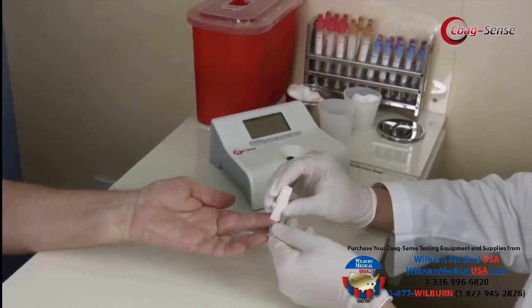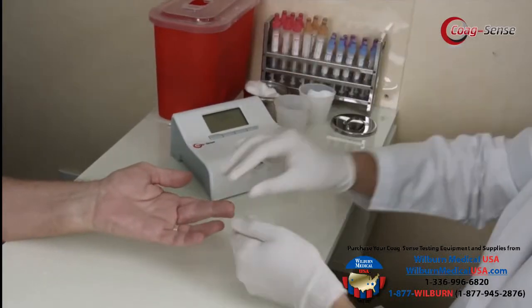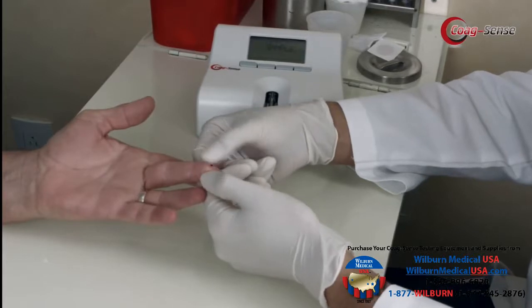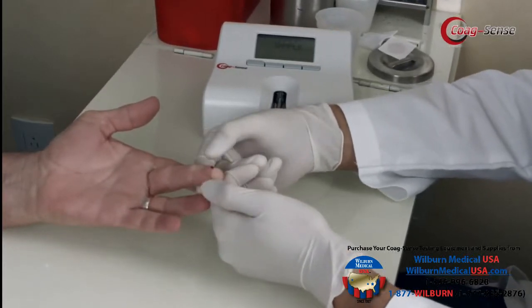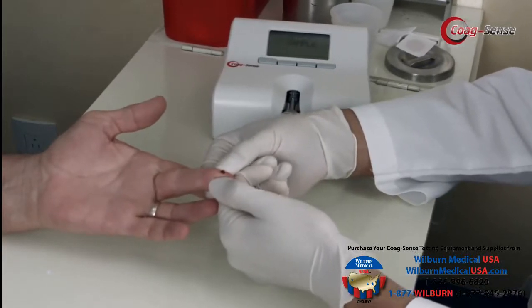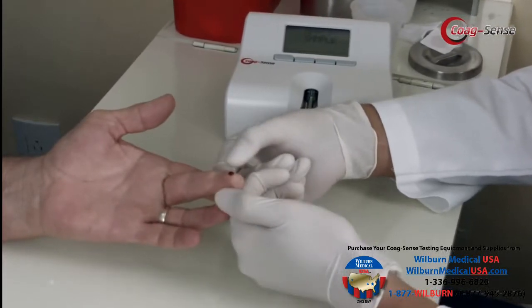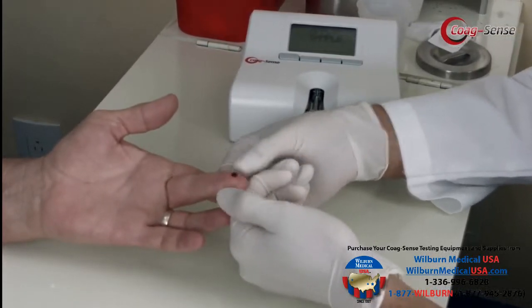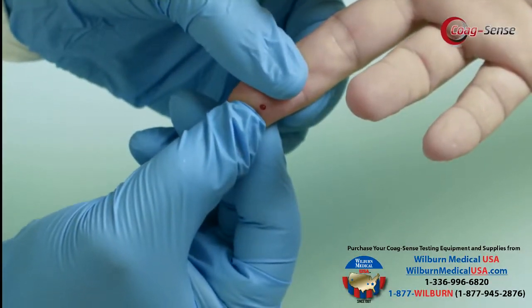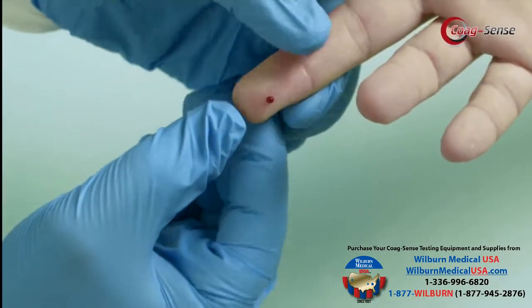Place the lancet against the skin. Holding the body of the lancet, push down firmly against the finger. Put pressure at the first finger joint, then gently squeeze the finger from the sides to get it started. Lowering the patient's hand and arm so that the fingertip is below the heart helps the blood drop form. Keep squeezing the finger until you produce a pea-sized bead of blood. Note: squeezing the finger stick site excessively or milking releases interstitial tissue layer fluid containing tissue factors that can cause unreliable results.